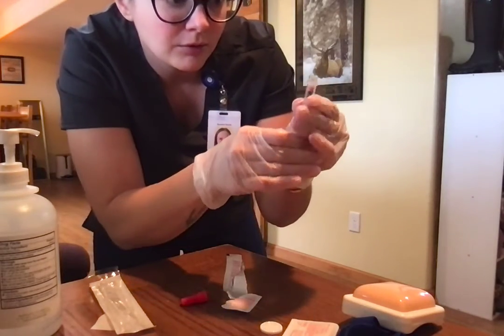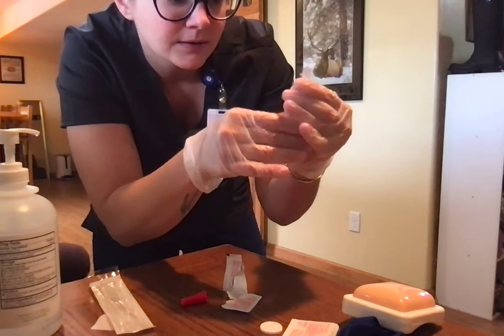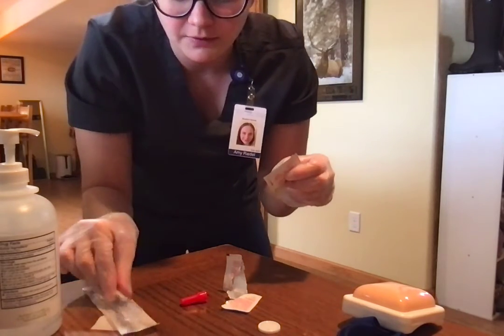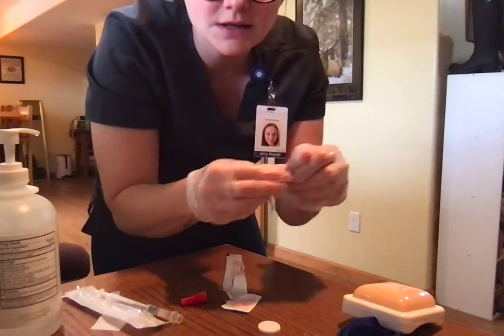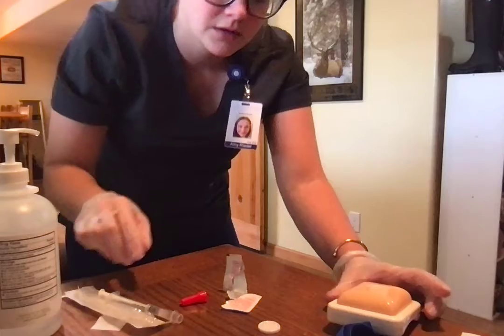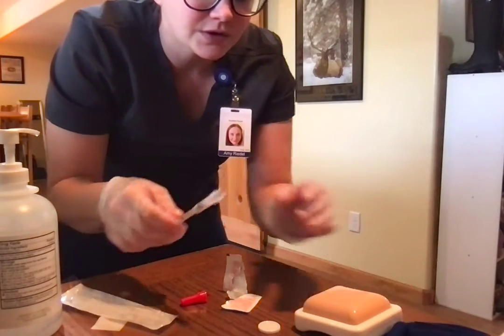Okay, and then I'm just going to slide the cover up without recapping it as I set that down for a second to clean the patient's skin. And we're going to go in a circular motion to the outside, and let that dry for a second.